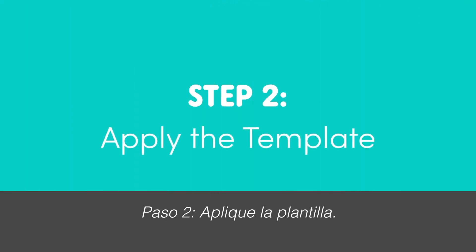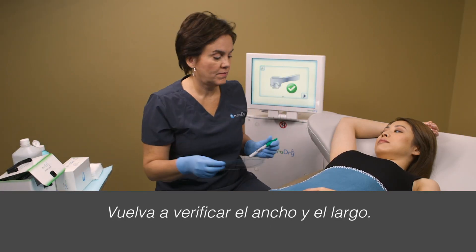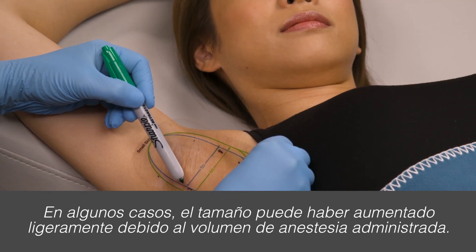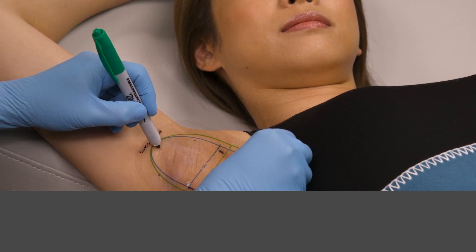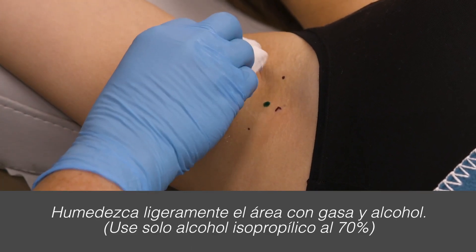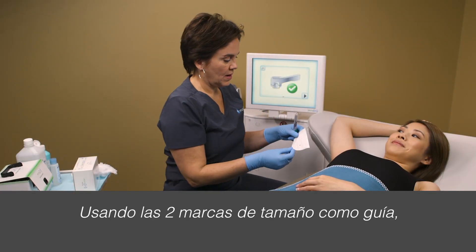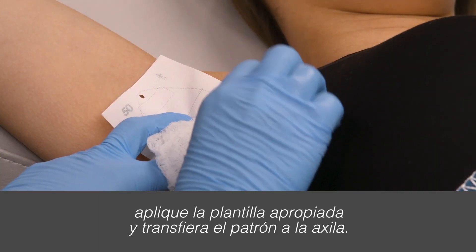Step 2: Apply the template. Re-verify the width and length, as in some cases the size may have slightly increased due to the volume of anesthesia administered. Using a different colored marker, use the sizing tool again to make marks through the holes on the top and middle of the sizing tool. Slightly dampen the area using gauze and alcohol. Using the two sizing marks as a guide, apply the appropriate template and transfer the pattern onto the underarm.